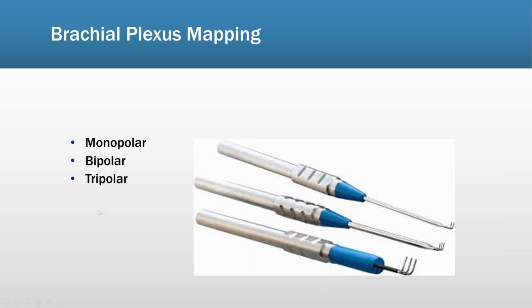For peripheral nerve surgeries, we do monopolar, bipolar, and tripolar stimulation. The monopolar can be sharp or blunt, or ball tip for pedicle screw. Bipolar can be a hook bipolar, side by side, or concentric bipolar. And tripolar are the most important for peripheral nerve monitoring. The two sides are anodes and the middle one is plugged into cathode.